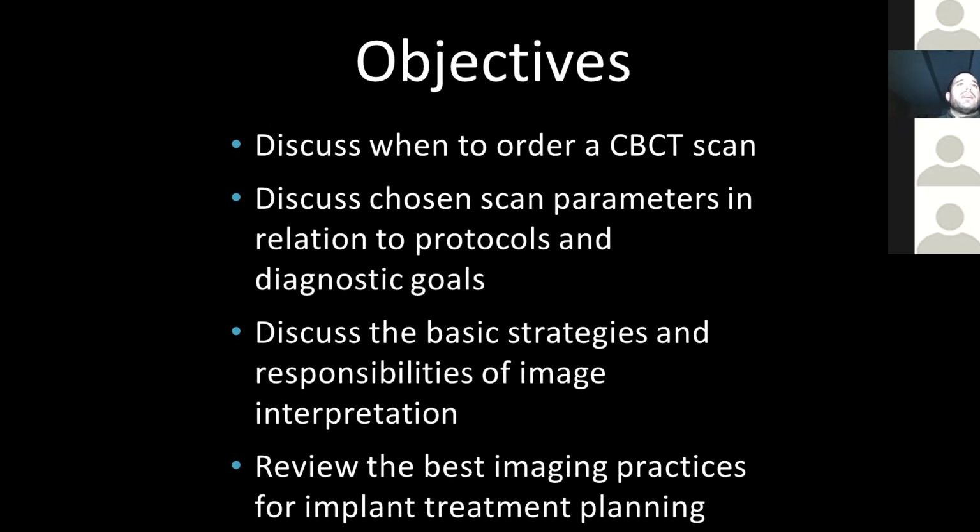And again, to look at the second part of your question, whether a mammogram equals 10,000 dental X-rays really probably depends on the specific mammogram technology and the specific dental X-ray technology, both of which have changed quite a bit in the last 5 to 10 years. And in both directions, doses have gone down. So I really can't answer that exactly without looking at the specific numbers.